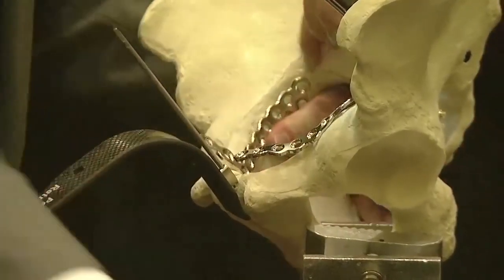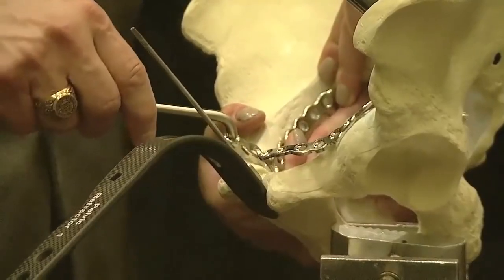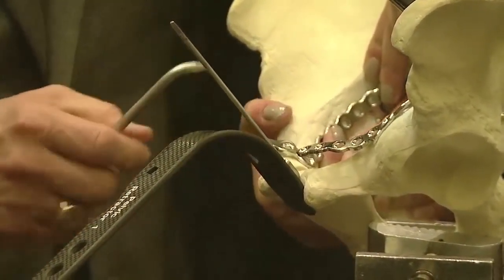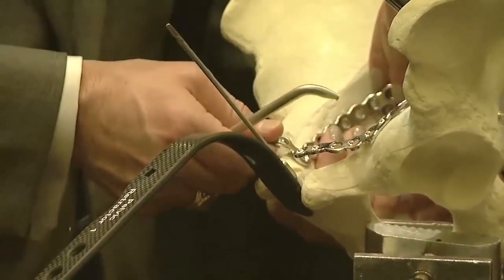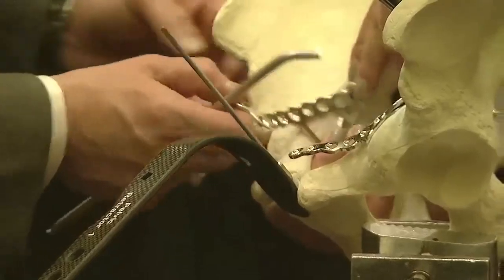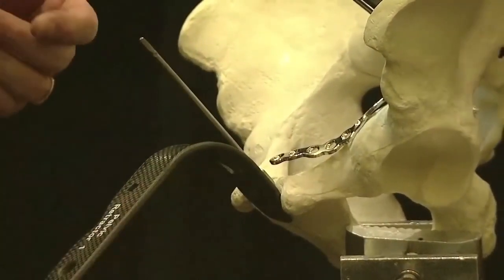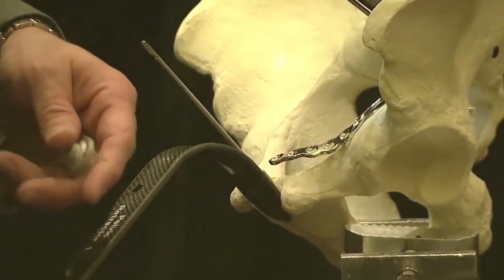Now, I'm going to try to bend it over the top of the pubic body, but the plate is not screwed down. Even with that, you can get the idea. We can bend it over the top and then put screws into the pubic body, as Claude was just showing you. So those are the major features of the new implants and devices and retractors.